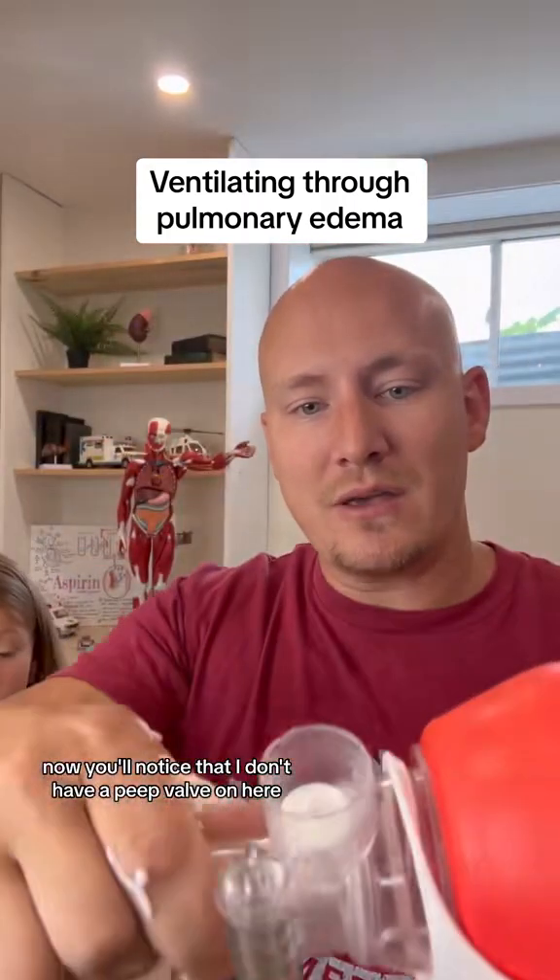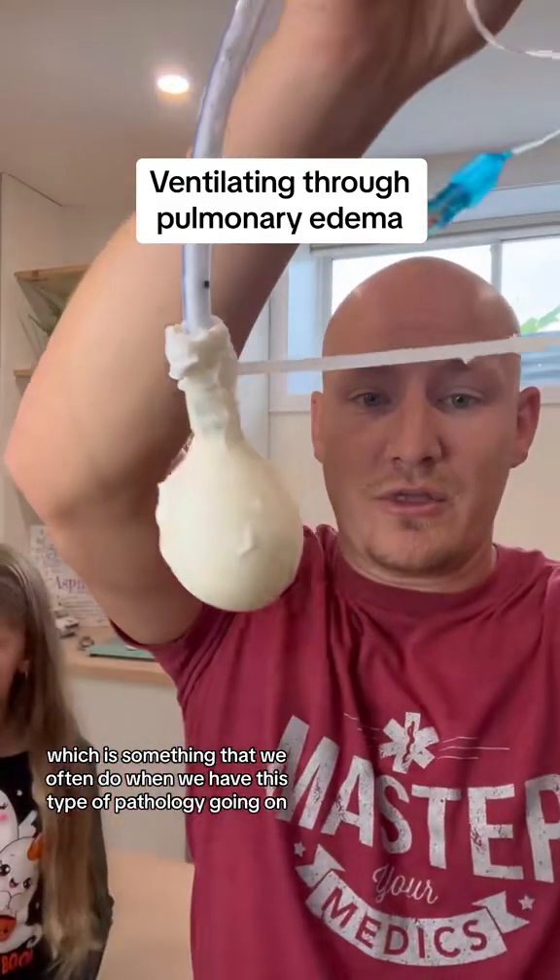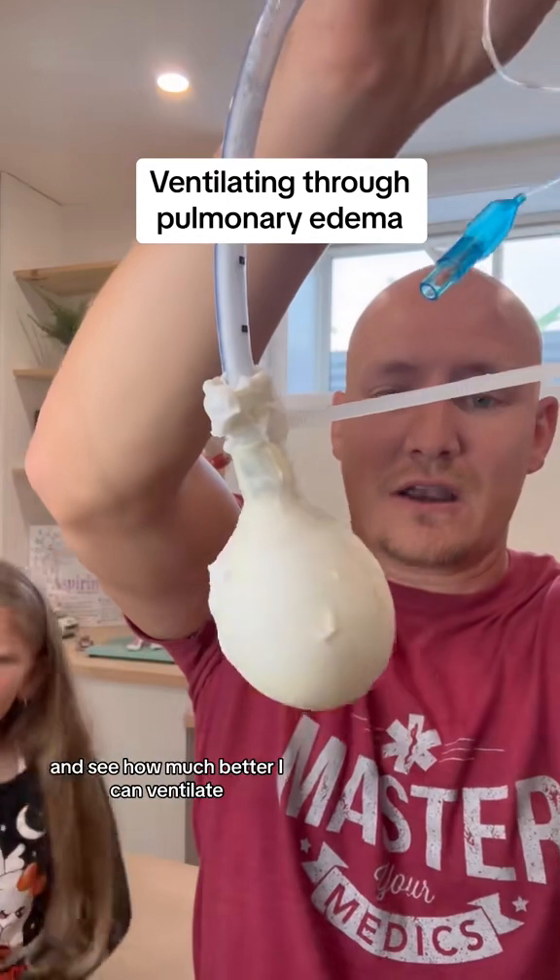You'll notice that I don't have a PEEP valve on here. So let's use that PEEP valve — something we often do when we have this type of pathology — and see how much better I can ventilate.